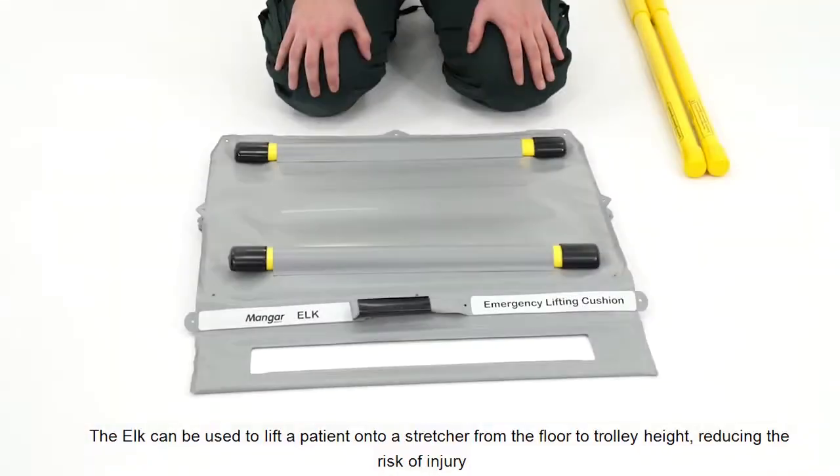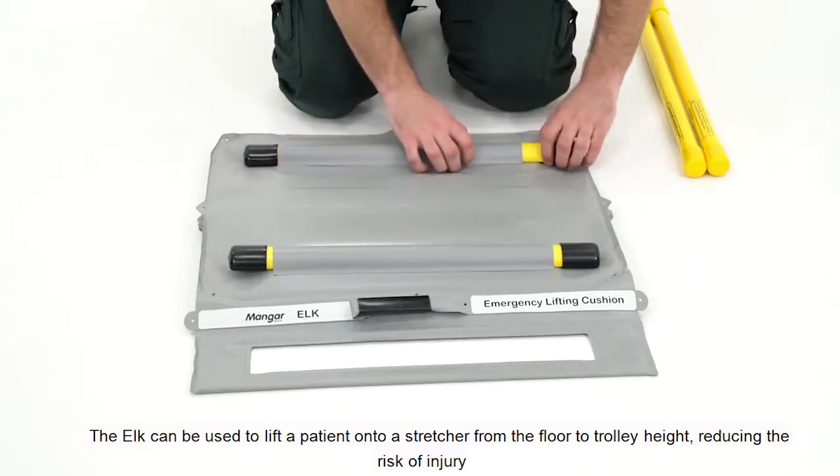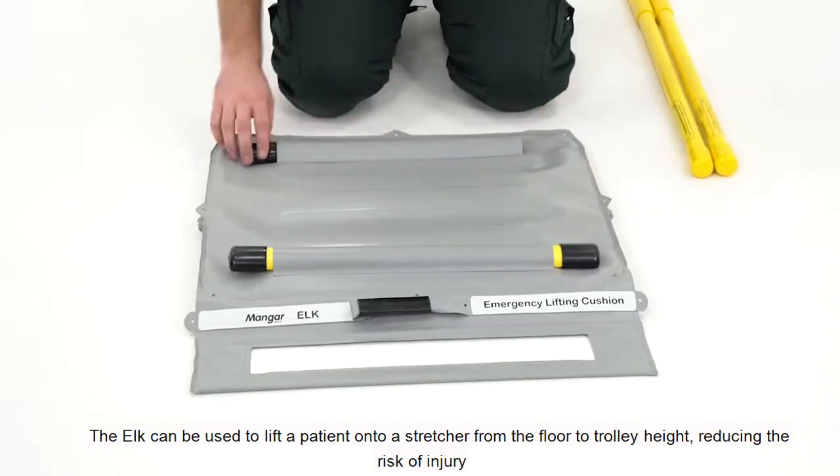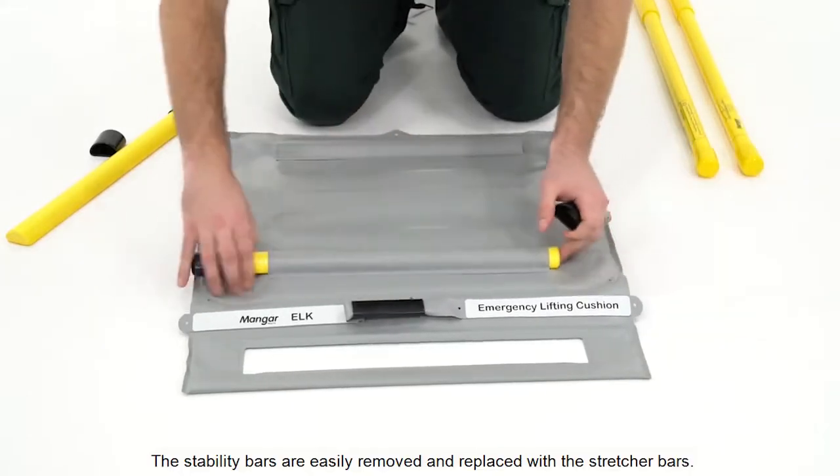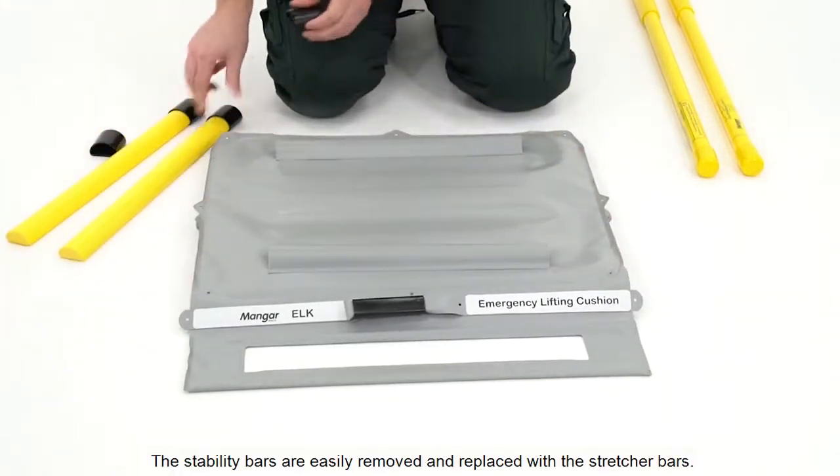The ELK can be used to lift a patient onto a stretcher from the floor to trolley height, reducing the risk of injury to the paramedic. The stability bars are easily removed and replaced with the stretcher bars.